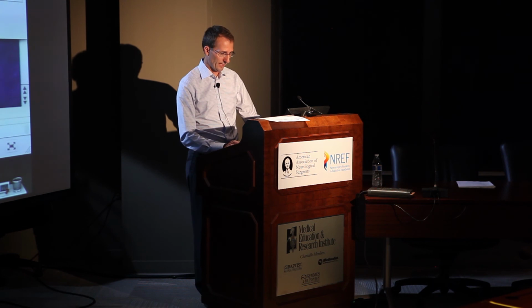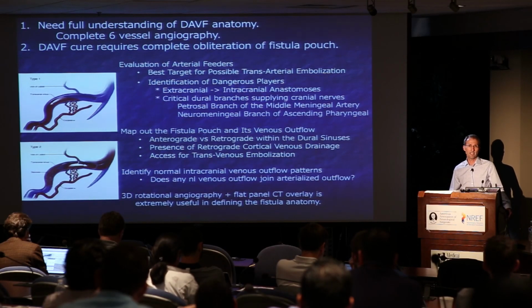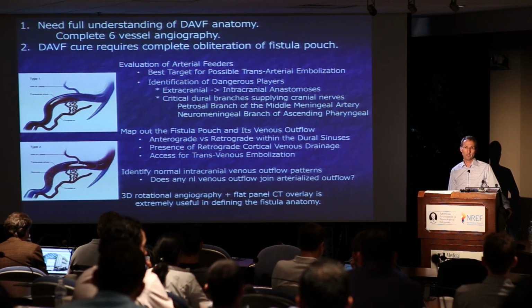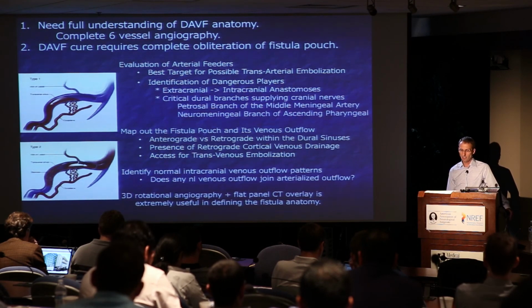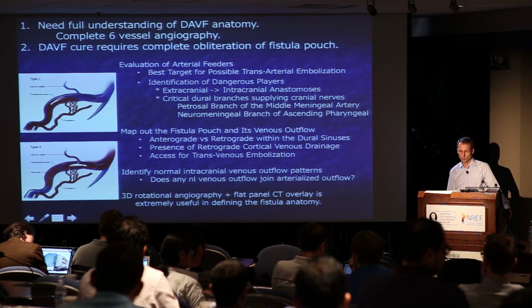So I will end just by saying, I think what's already been echoed by a lot of the discussion, which is, and I'm glad it went that way, that for these cases we can talk about technique. How do you navigate to the fistula pouch? How do you use Onyx? That's important. But there's little doubt to me that the main technique, the most important thing we do, is spend a lot of time figuring out the anatomy of what we're dealing with. These are very complicated cases. They're beautiful cases, actually. But I agree with what everyone has said, that we need to know what we're doing.